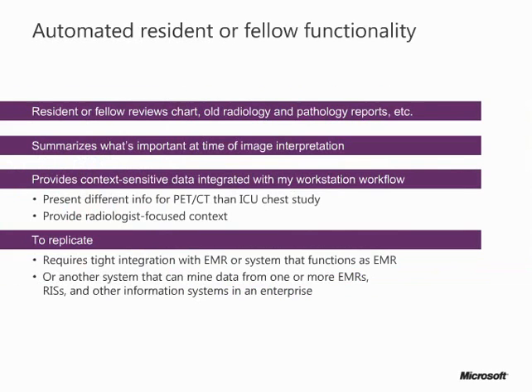And so as far as the automated resident or fellow functionality, what are some of the things that I would like to have an automated system do? And those include the ability for review of information in the chart. I'd like it to look at old radiology and old pathology reports. It'd be great to have that information summarized for me.